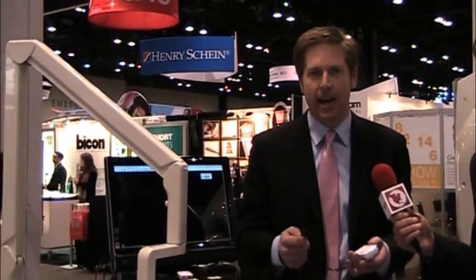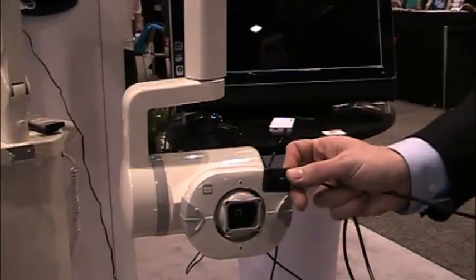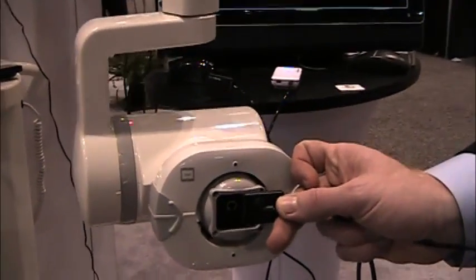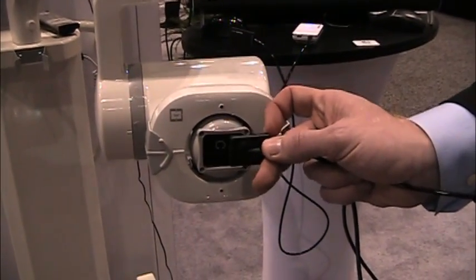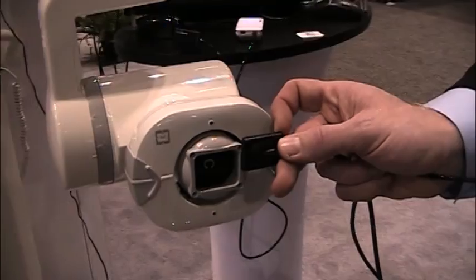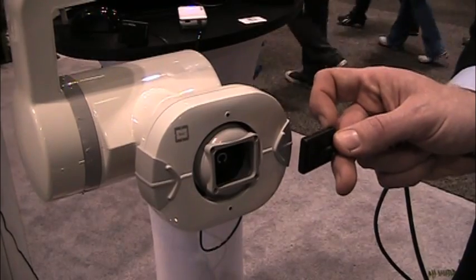The most exciting feature is the intelligent positioning system. We know how important it is for taking x-rays to minimize retakes and get the correct shots every time. The IPS system works in conjunction with the x-ray generator head and the sensor together, ensuring they are completely parallel before you take the x-ray to minimize cone cutting and poor x-rays.